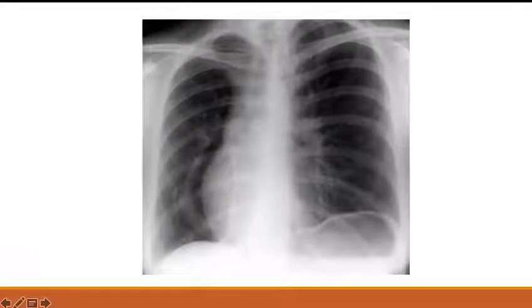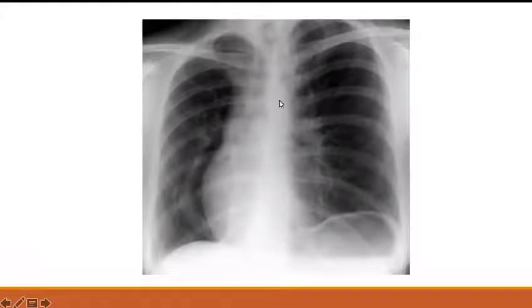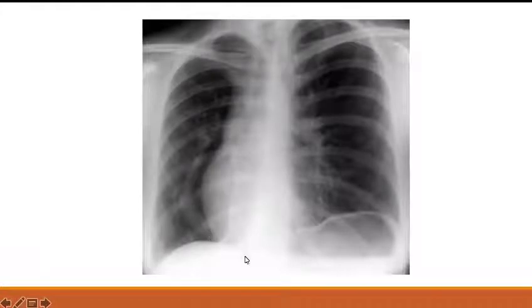At first instance you may think this is dextrocardia, but when you see this you know it is the scimitar sign or Turkish sword sign — suggestive of classical scimitar syndrome. This is dextroversion, not dextrocardia — the right lung volume is smaller and hence the heart is pulled towards the right. It is an infracardiac PAPVC — partial anomalous pulmonary venous drainage — where only the right-sided veins drain into the IVC.